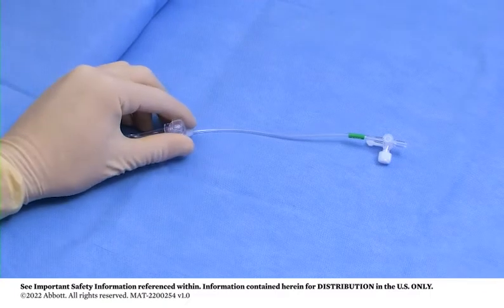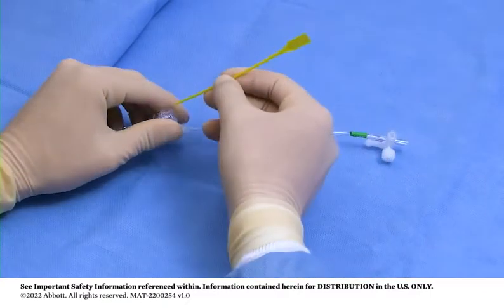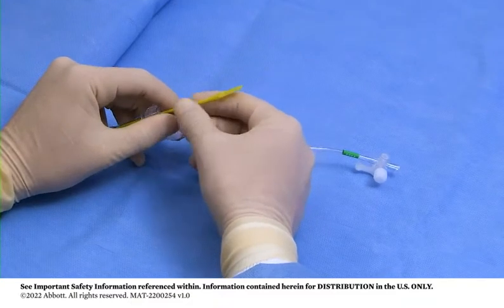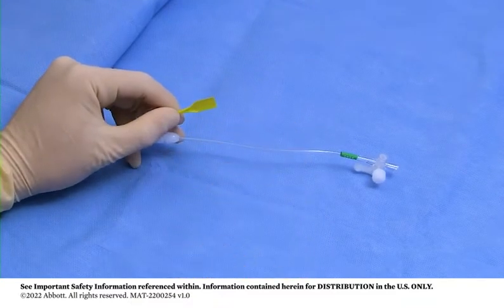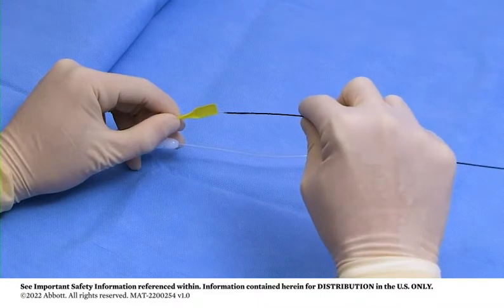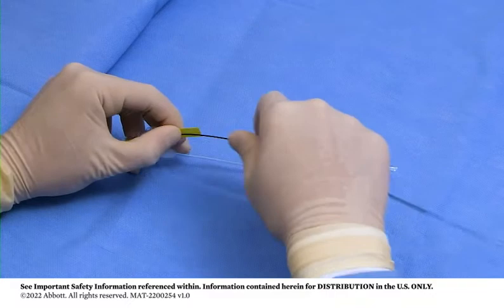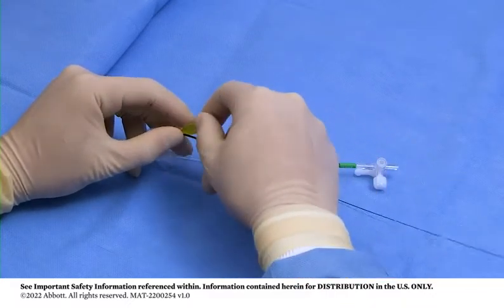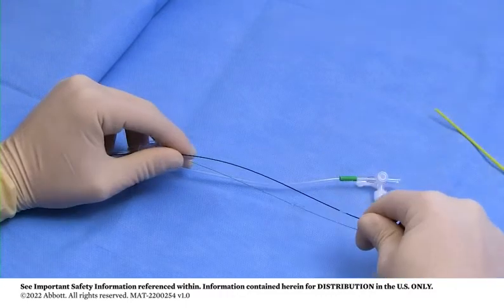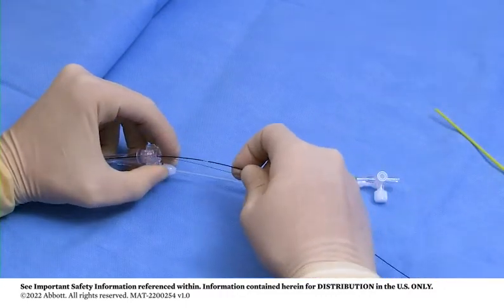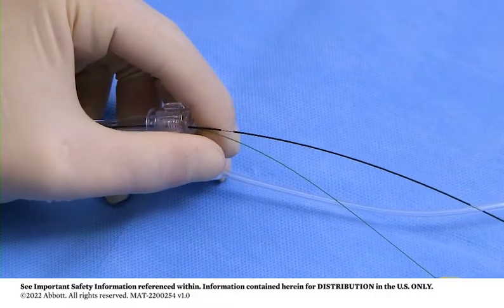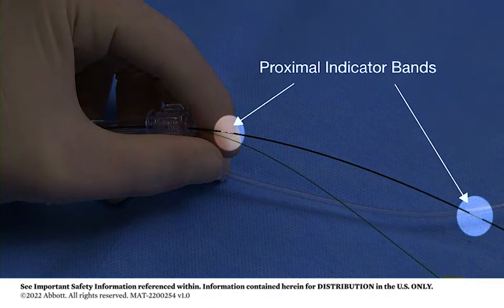Use the introducer tool provided to pass the loaded delivery catheter and bare wire through the hemostasis valve of the guide catheter or introducer sheath. Notice the proximal indicator bands are positioned at 90 centimeters and 100 centimeters from the distal tip of the delivery catheter to aid catheter introduction.